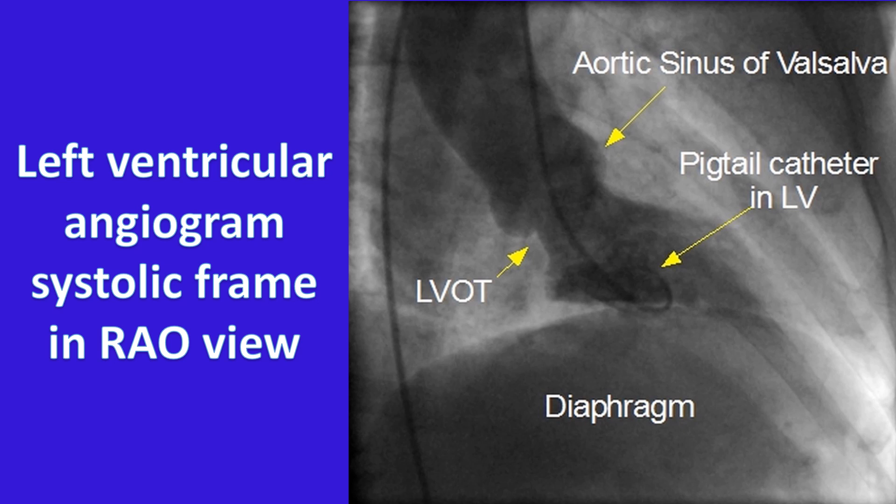The pigtail should be in the cavity and not in the inflow or outflow region. If it is in the inflow region, it can produce mitral regurgitation. A ventricular ectopy induced by the catheter can also produce a whiff of mitral regurgitation.